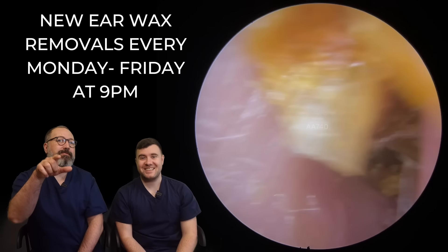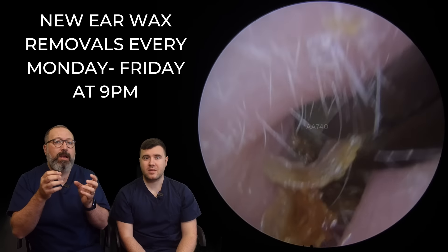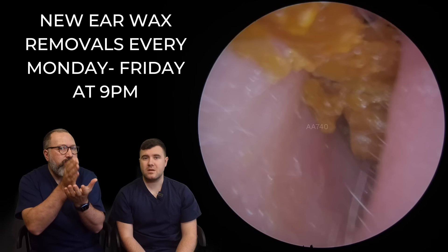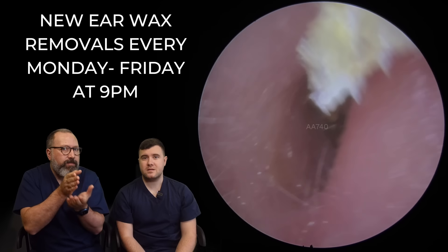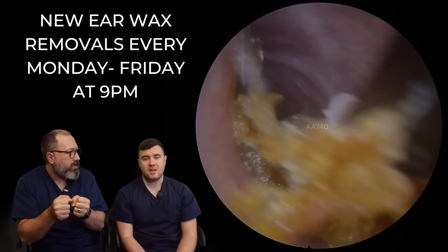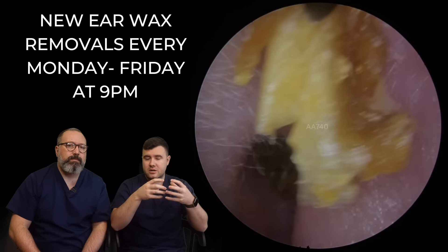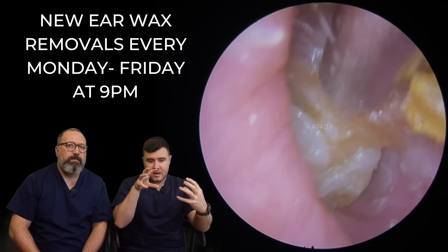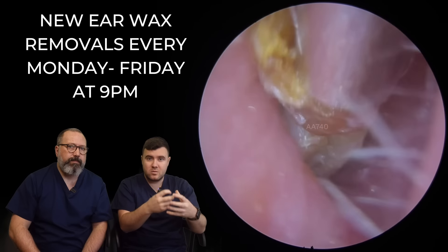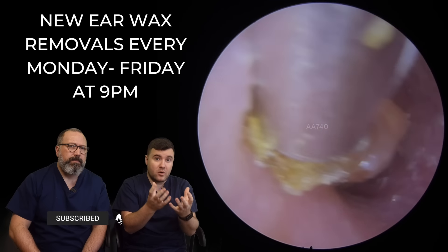With these, you do tend to switch tools a lot because the consistency of the skin changes so much between these layers. Suction is great and you can get a really good grip with suction, but the difficulty is when these layers are hard and they're standing almost vertically, it's really difficult to get that real suction grip — and believe me, the skin holds on like crazy. It does not want to come away. It's perfect when it's slightly softer, so that the standard size suction tube, as it starts gripping the front section of the skin, you tend to see it start folding into the tube and you get a much better grip. And that's where you see us start doing all these wiggling motions to try and detach the skin from the ear canal.